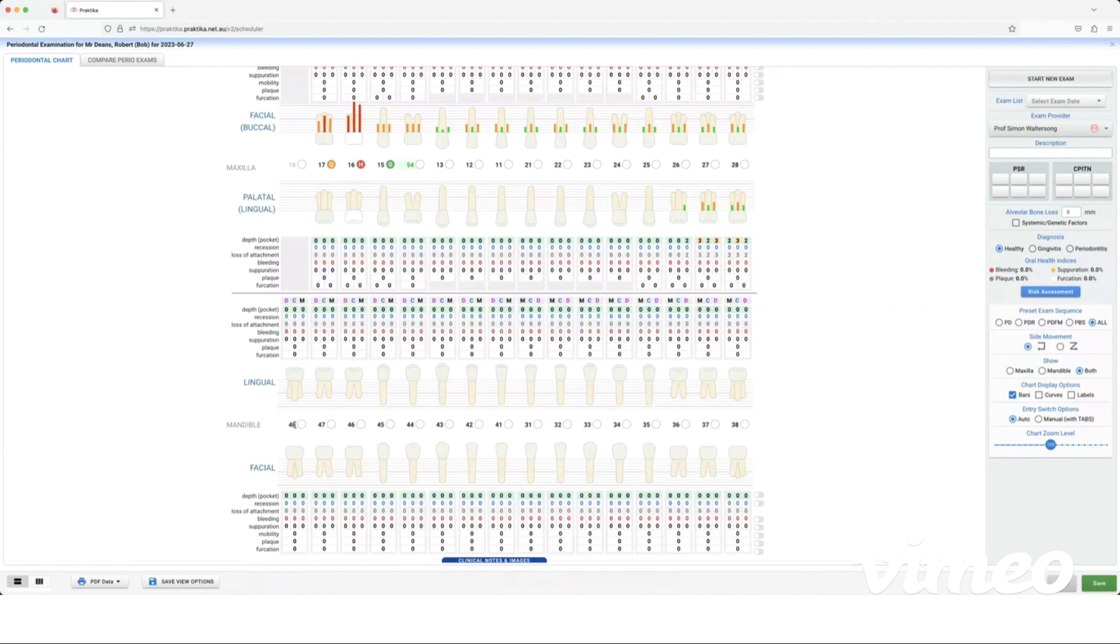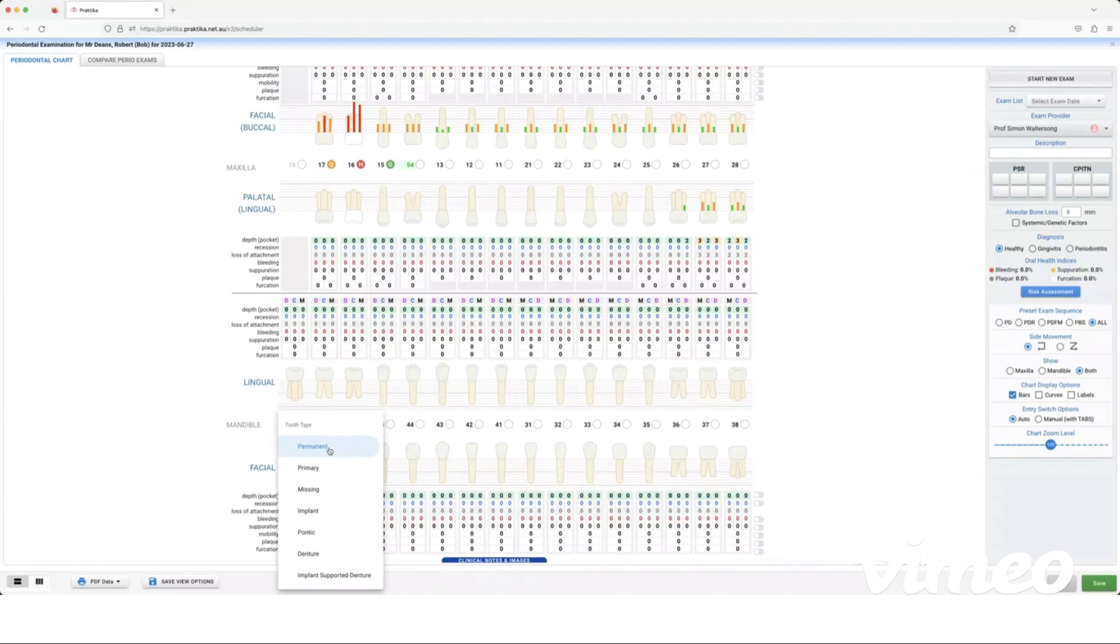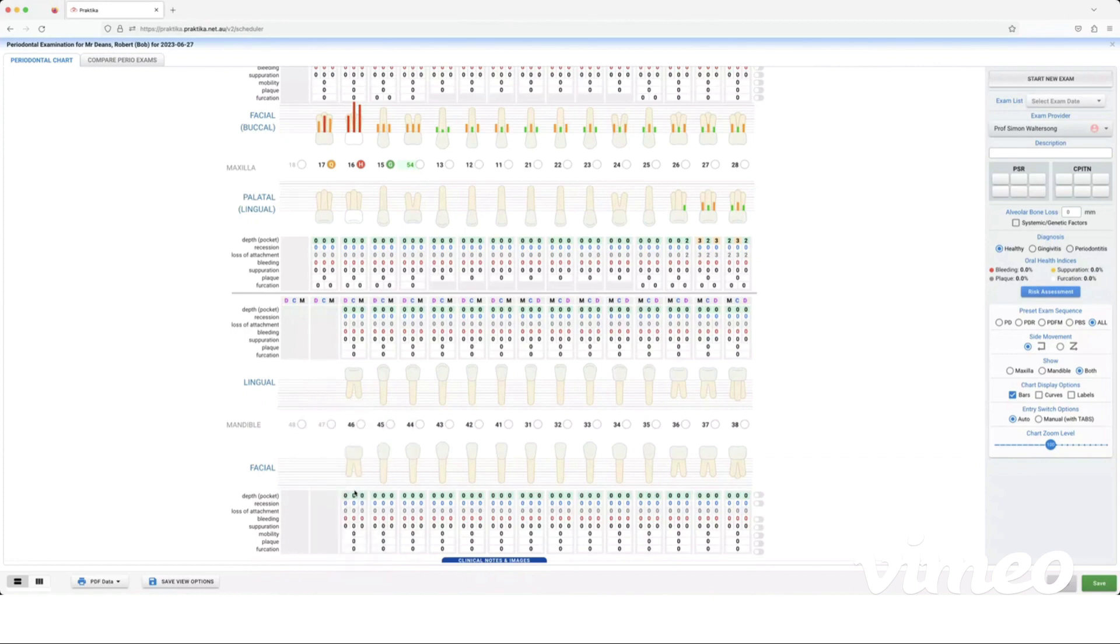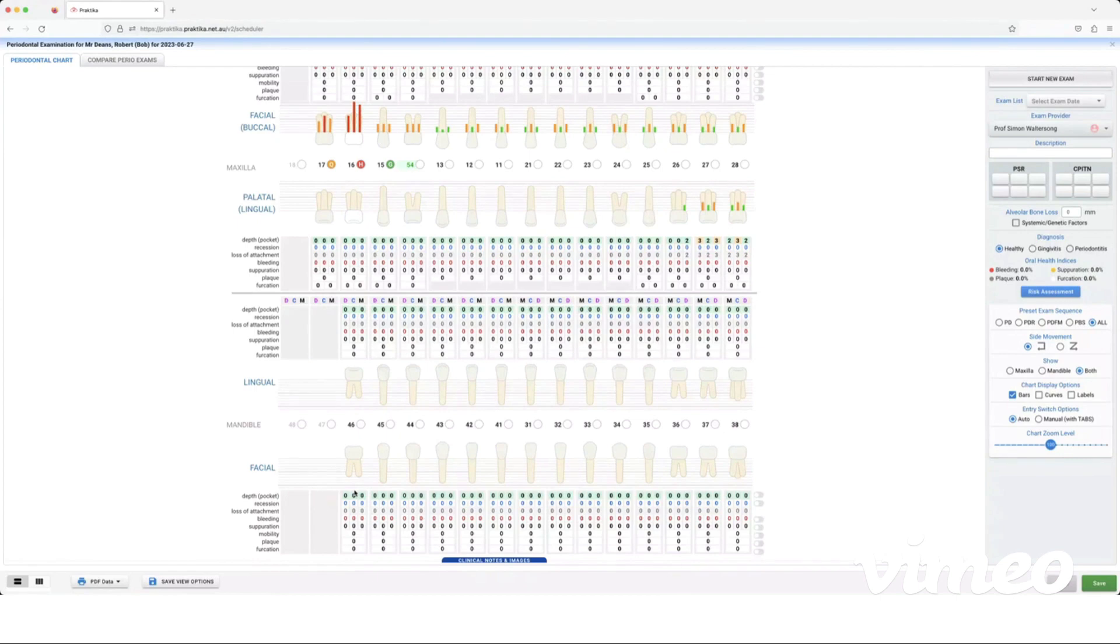So if it's a primary tooth I can change it to primary, or if it's missing I can change it to missing. If I mark it as missing or implant, whatever it is in here, it will reflect in the restorative chart and vice versa. Anything that I've marked in the restorative chart, if I've marked missing teeth or implants, it will be reflected in this chart. I must mark it before I begin the chart though.